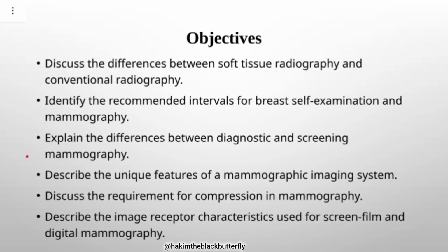Something might be growing up in there without your knowledge. If you do screening, maybe once a year, you can actually see these microcalcifications before you even get any symptom. And mammography is the best modality for that. Those microcalcifications cannot be seen on ultrasound, cannot be seen on MRI, can't be seen on CT. It's only mammography that can do that.